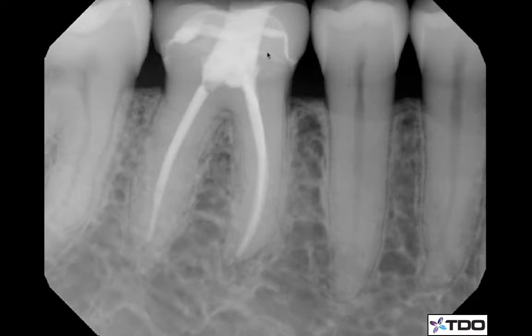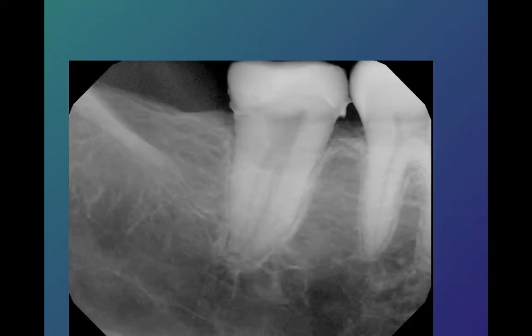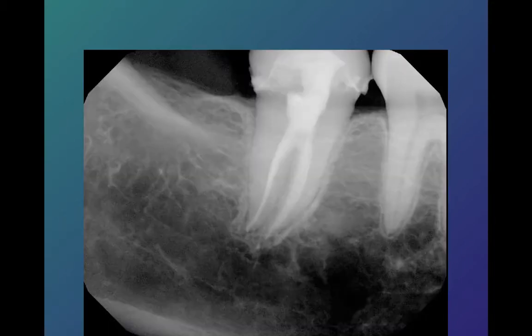The old idea of straight-line access and going straight up from the pulp horns is really not where modern endodontic therapy is or should be, because we've all had the frustration of seeing root canal treated teeth come back with vertical root fractures. We really need to be focused on doing everything we can to avoid that. This is another example of using what we have and preserving what dentin we can in the middle of the tooth.